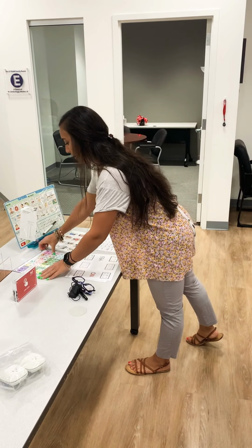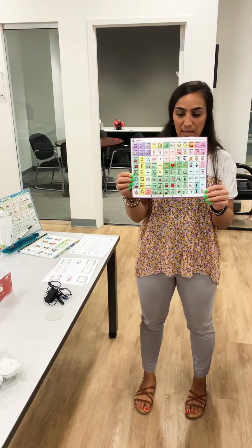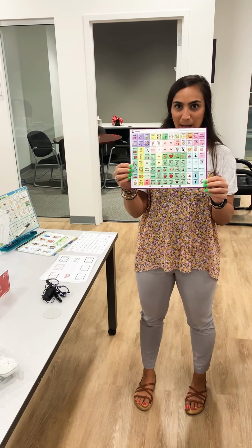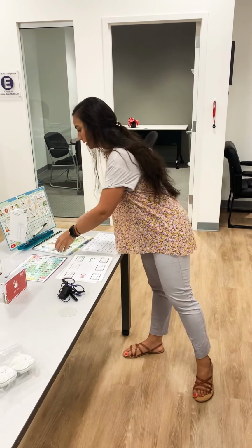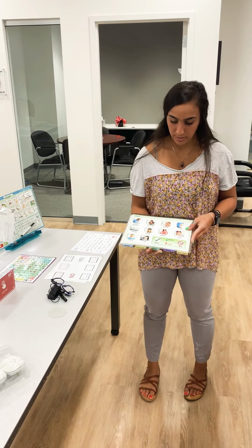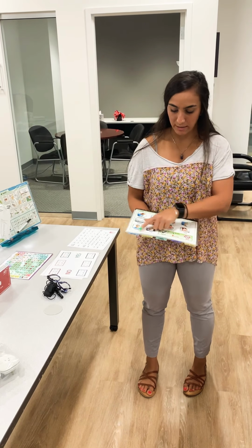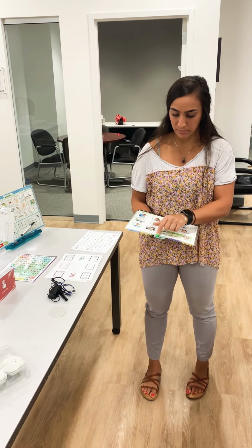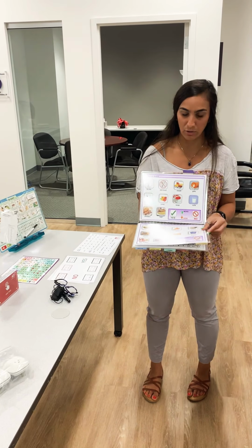They do also come in a variety of languages. So this one, for example, has the same phrases and words on the front and back, but one is in Spanish and one is in English. And then what you see here is actually a booklet of different communication boards. They're categorized at the bottom by different categories, and within each category there are different phrases that you can use to request.